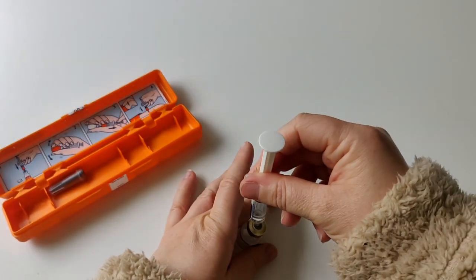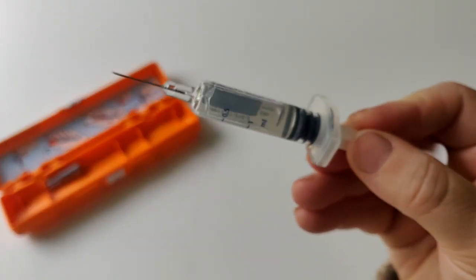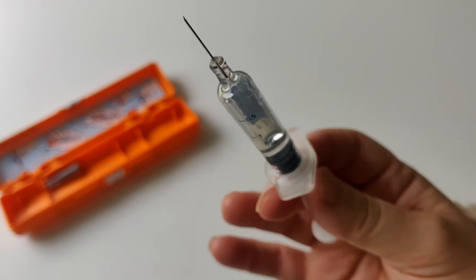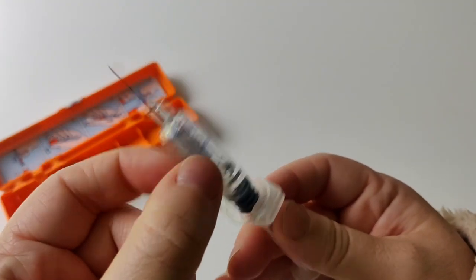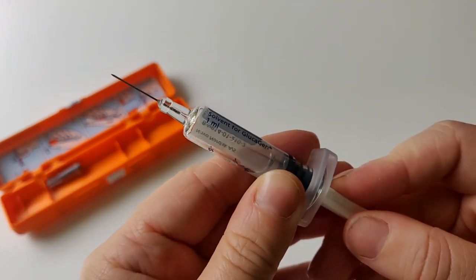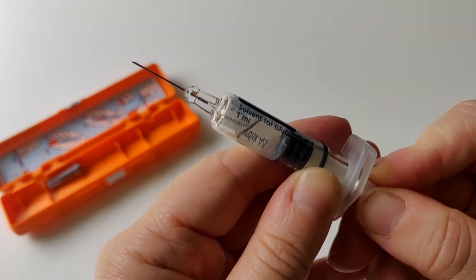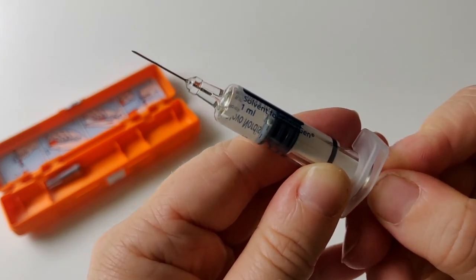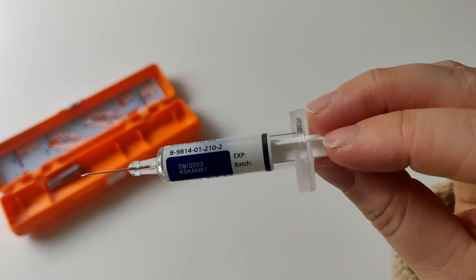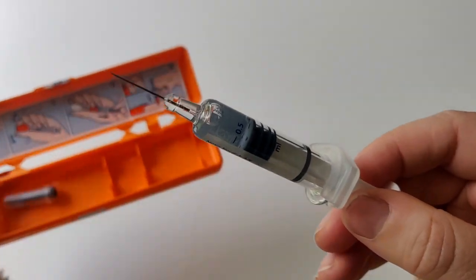It's important to remove air bubbles — I've never actually done this before, so this is a learning experience for me too. With the needle pointing upwards, tap it with your finger to get air bubbles out. If any are visible at the top, gently push the plunger slightly to expel them. You can see the air coming out — that looks good. The solution is in the needle with no air bubbles, as best as possible for this demo.